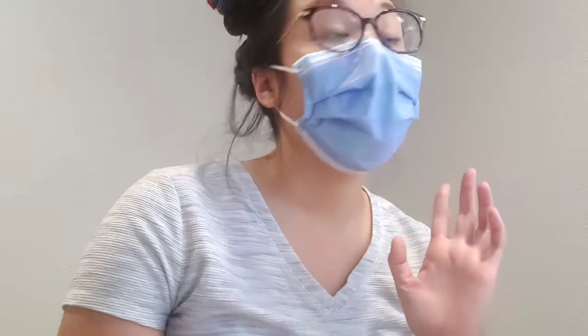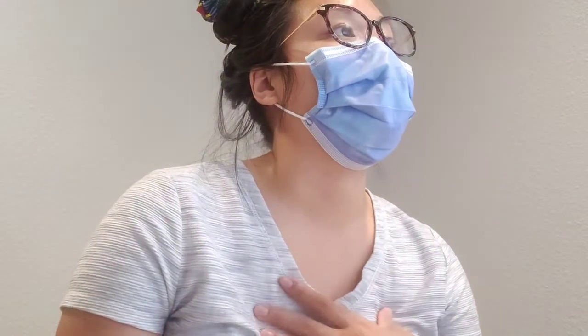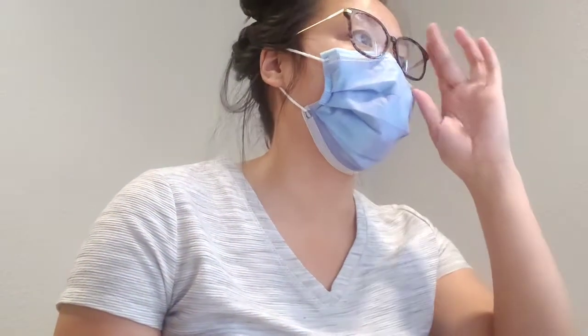Okay, for routine abdomen pelvis CT scan, the recommended scan field of view is 50. I put 65. The answer is 50 centimeters, recommended scan field of view. But it depends on a person's anatomy, right? But that's a recommended. Okay.